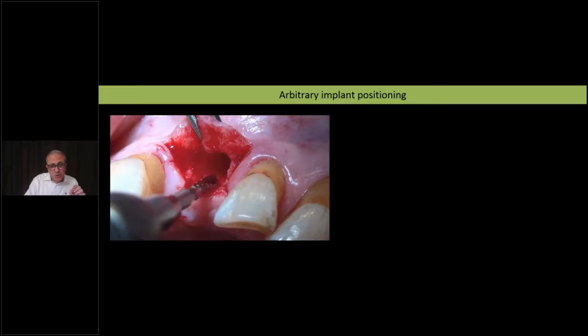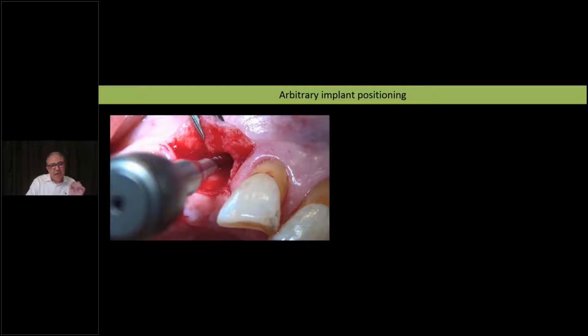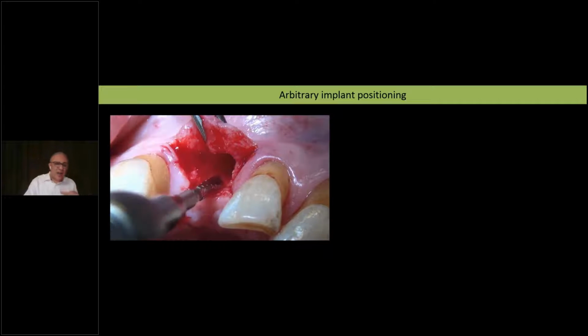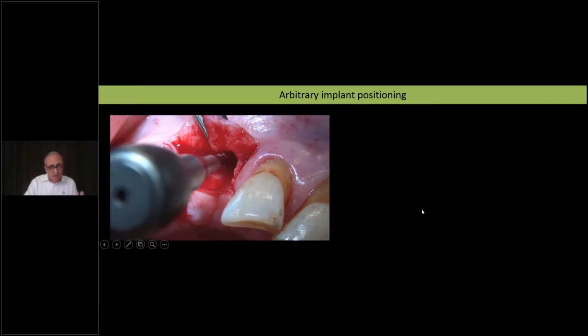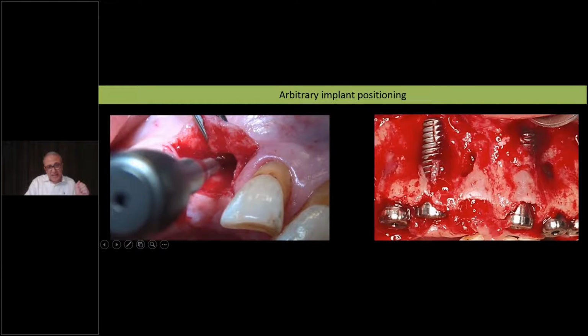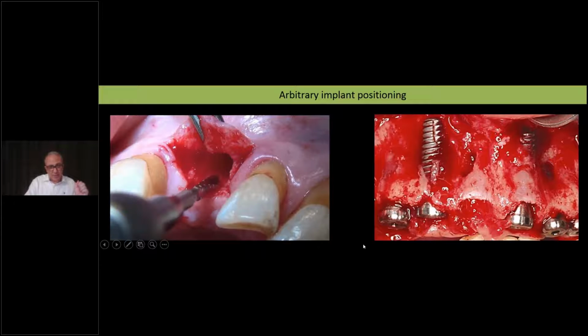And I'm showing this video to you here just to realize the fact that this is the main error that causes faulty implant positioning, which is the slippage along the architecture of the socket anatomy itself with the pilot drill. So once you do this arbitrary, what I call arbitrary implant placement, you see this result all the time. If you let your drill slip like that, you will end up with violation and improper implant placement.